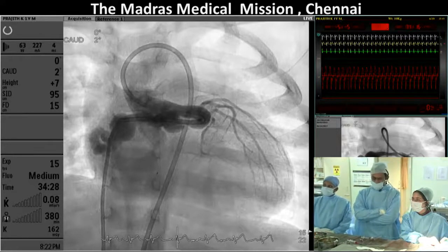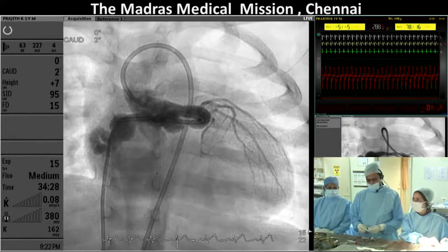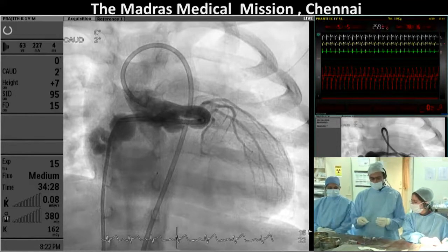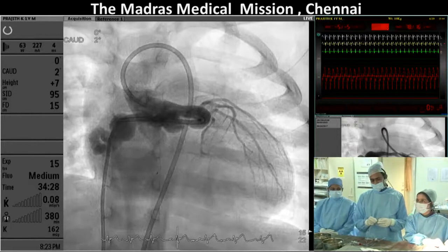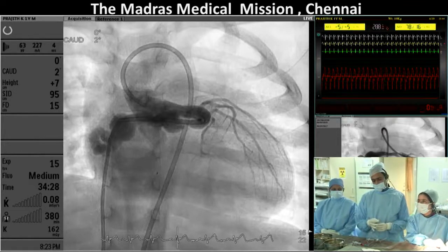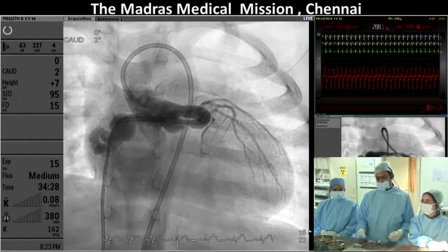Yeah, okay. Go on, Bharat. No, if I would not have seen that artery, Shiva, I would have done what you are saying. But after having seen that artery, if this child were to develop a sick sinus, God forbid, to give him a pacemaker lifelong is not something I'm saying that you will still be able to salvage it, but it would not be my strategy to give up on the sinoatrial nodal artery.